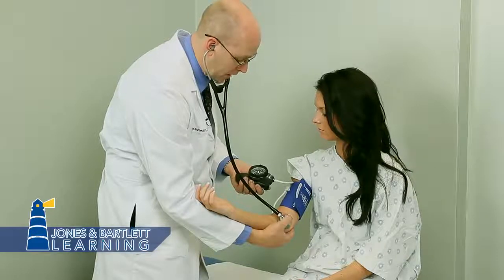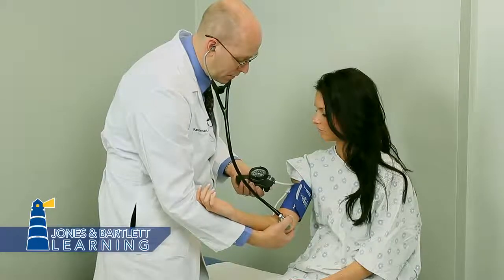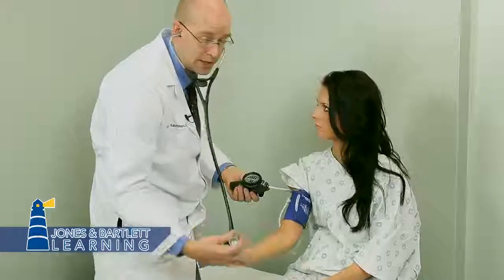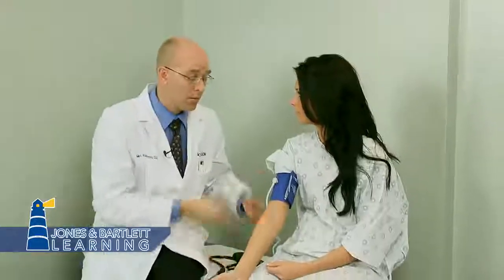And then I'm listening for the last pulse, and I hear the last beat around 60. So her blood pressure is 108/60. And that is your blood pressure measurement.